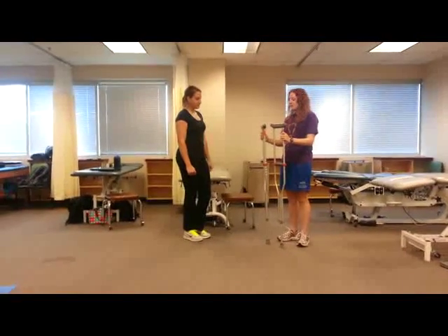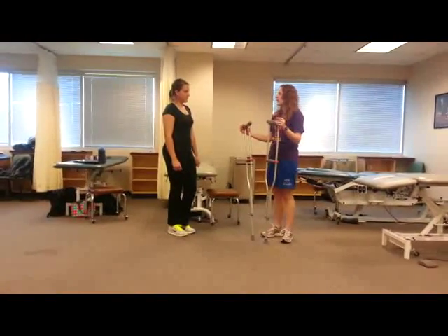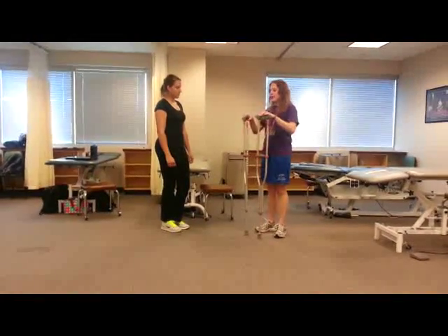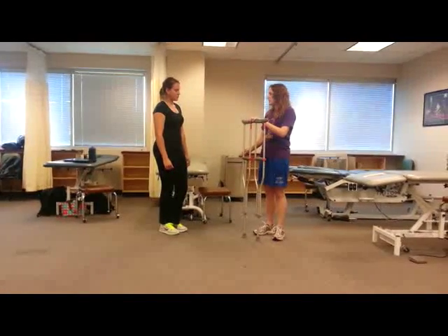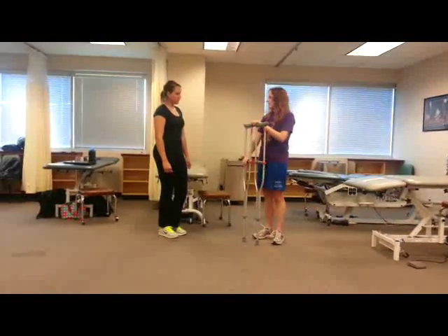So first, I'm going to show you just on myself how you would measure these, but then talk through how we would do it for a patient. The first thing that you want to do is worry about the length — the total height of the crutches — and then we worry about where our arm hits this piece.